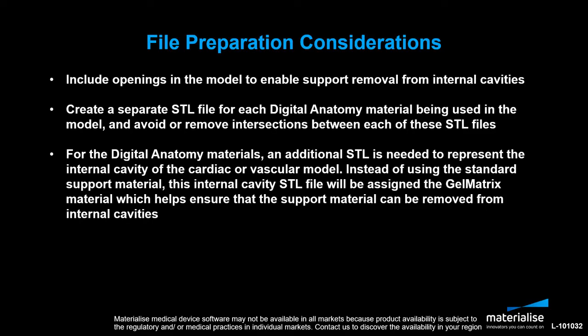Finally, for the digital anatomy materials, an additional STL file is needed to represent the internal cavity of the cardiac or vascular model. Instead of using the standard support material, this internal cavity STL file will be assigned the gel matrix material, which helps ensure that the support material can be removed from internal cavities.